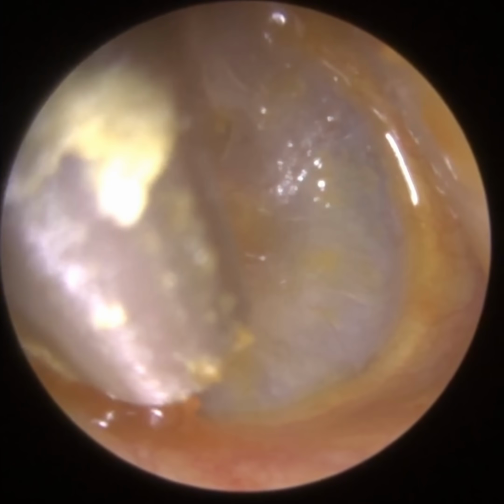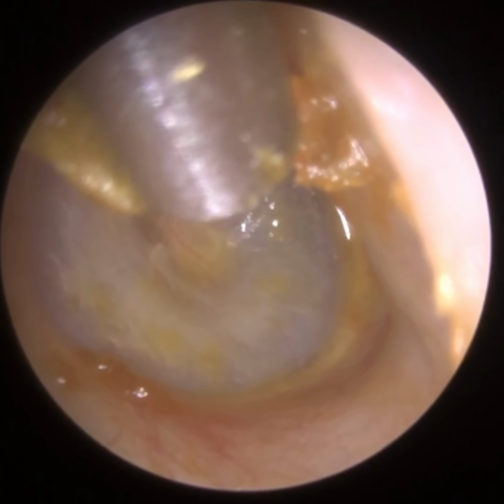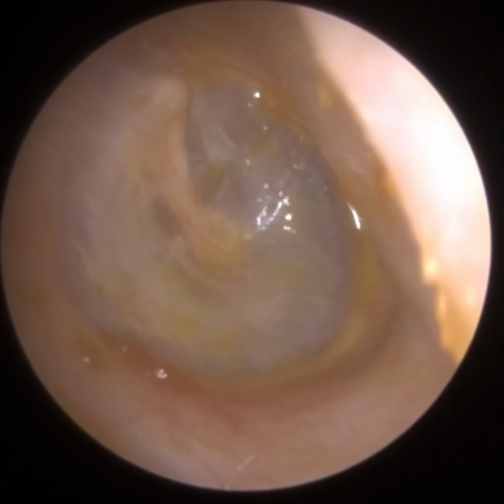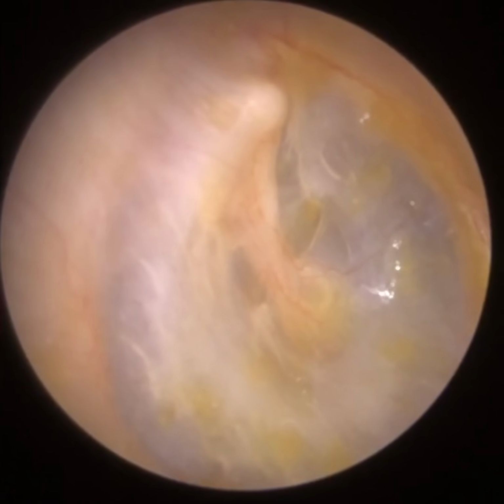And that view, even now after 6 years performing earwax removal with the eye clearscope that we developed, I'm still sometimes blown away by the view that we've managed to achieve. That's the patient's tympanic membrane, the eardrum, so it looks healthy enough.